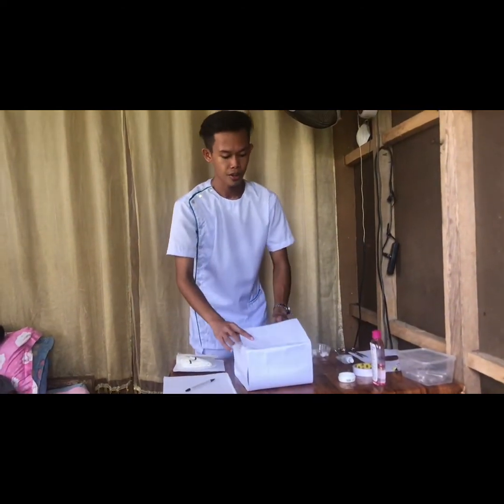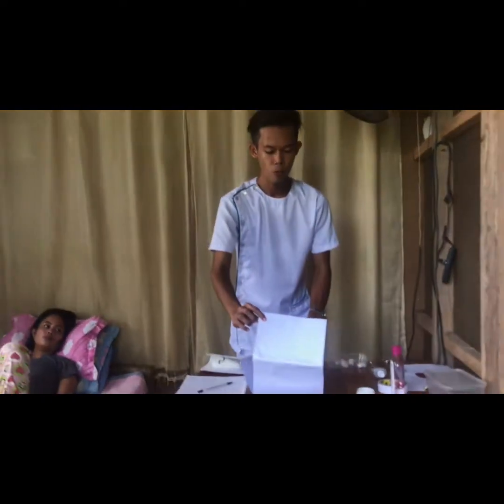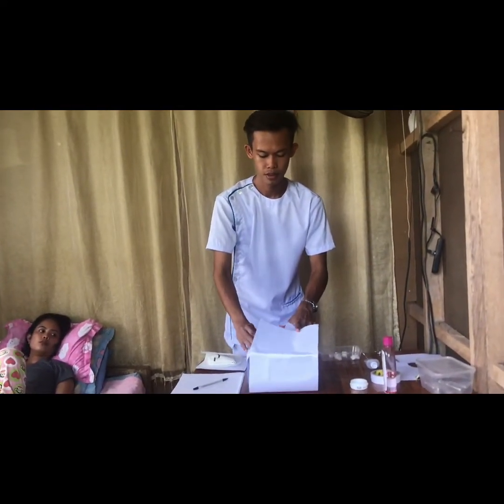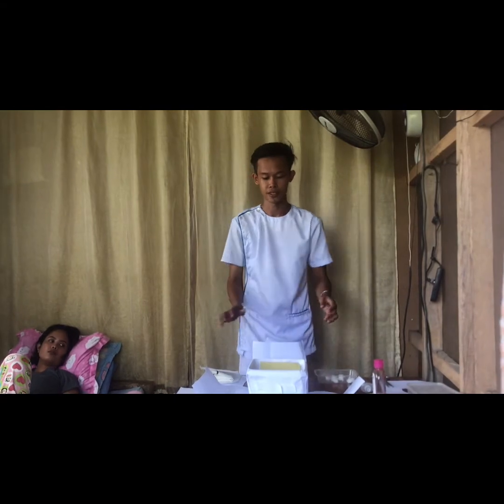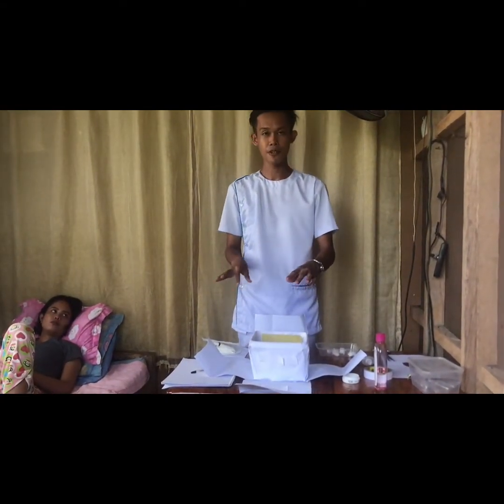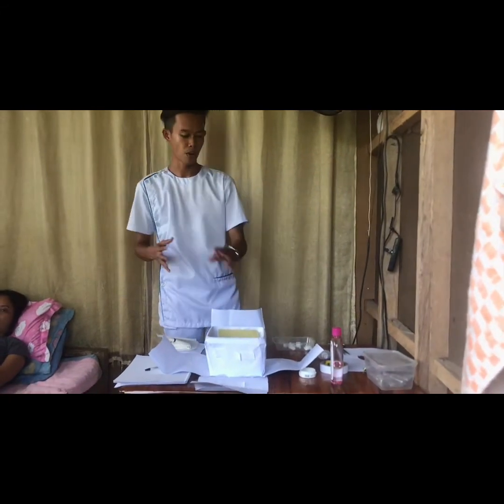So there is a rule when you open the catheter kit. We're going to open the upper portion first. Next is the left and the right portion, and then the down portion of the catheter kit. So for this time, the sterile items of the catheter kit itself are now exposed. We are not going to use our non-sterile hands to hold them.